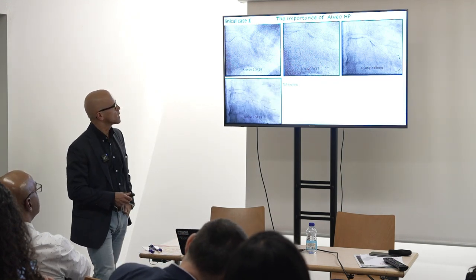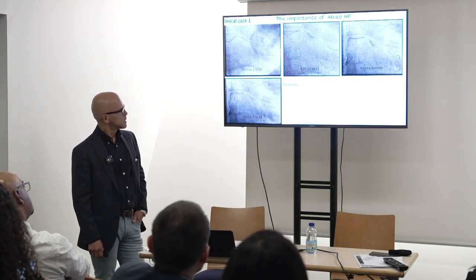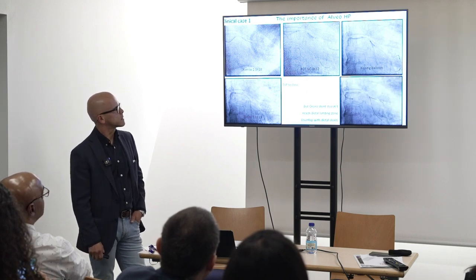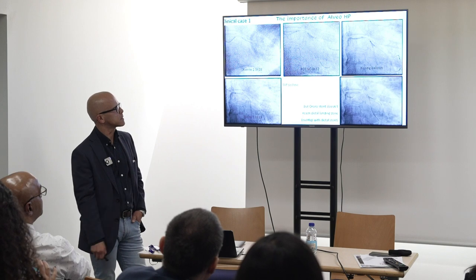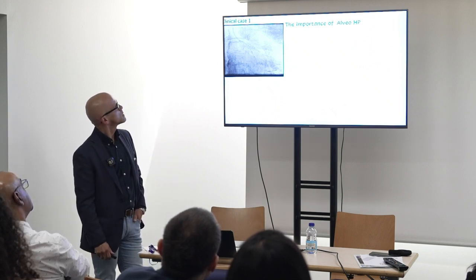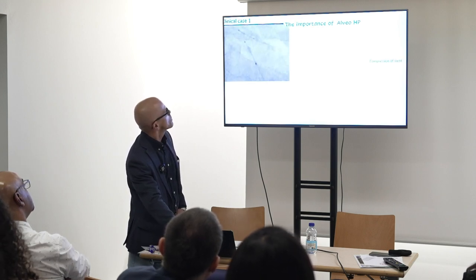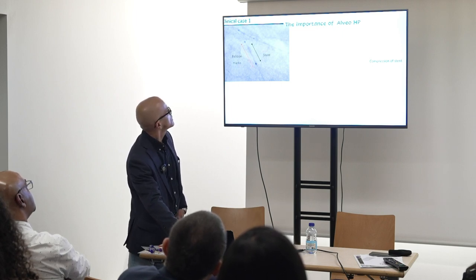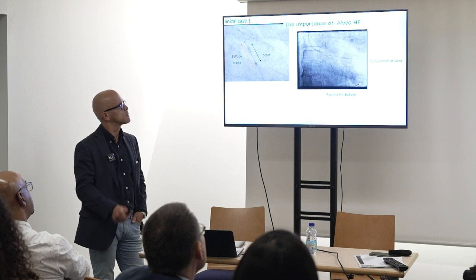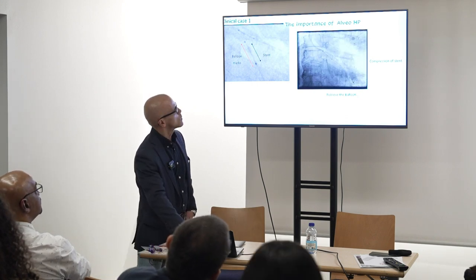When we tried to do the TAP technique and cross a second stent, a 2.5 stent, we had some problems advancing the stent. The Orsiro didn't reach the distal landing zone, and forcing it, we could see this image. You can see the marks of the balloon and the marks of the stent, so there was a compression of the stent. This is the balloon mark, this is the stent mark. So what I tried was to retrieve all the catheter, balloon and stent, but the balloon dislodged from the stent. The stent stayed there.